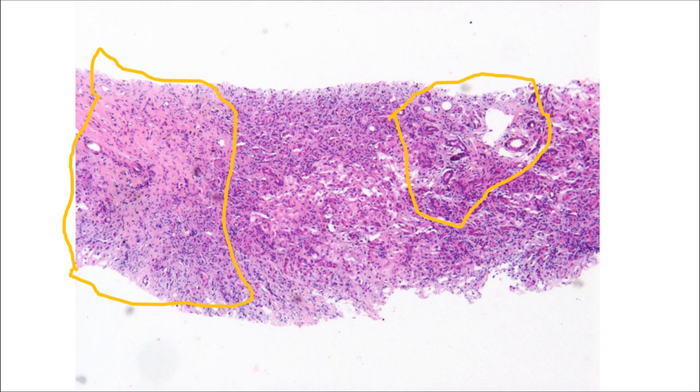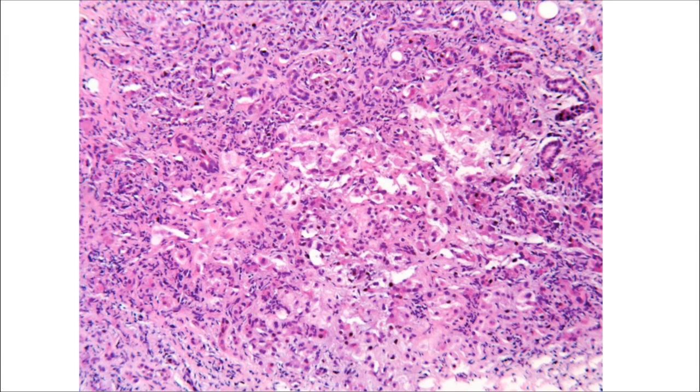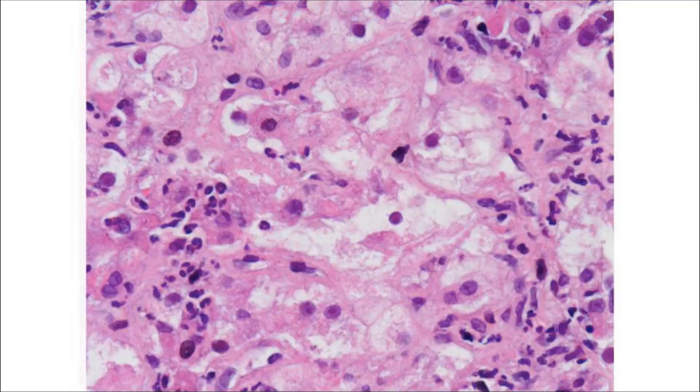However, as you turn towards the hepatocytes, you can now see that they have a very different tinctorial quality than that expected in pure venous outflow obstruction. And what we can see is that the hepatocytes are not decreased in size, but in actuality are increased in size with a rarefaction of their cytoplasm. And on closer power, what we can see is that these hepatocytes are increased in size compared to normal hepatocytes.